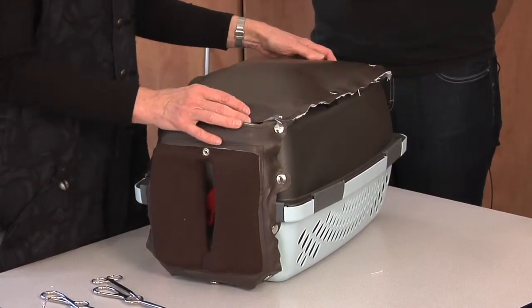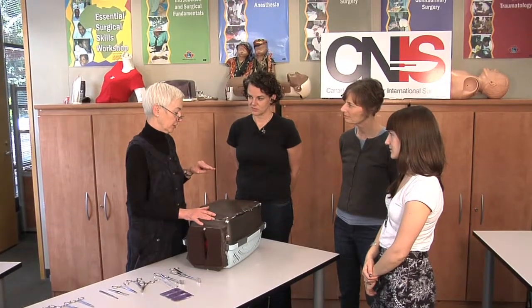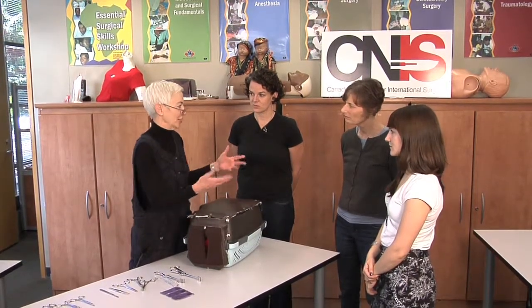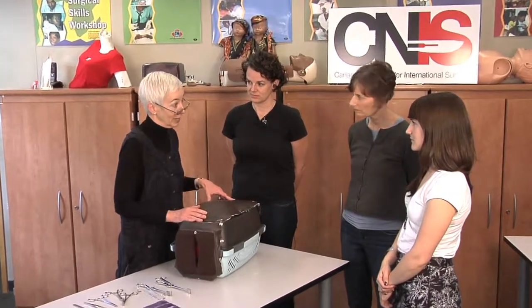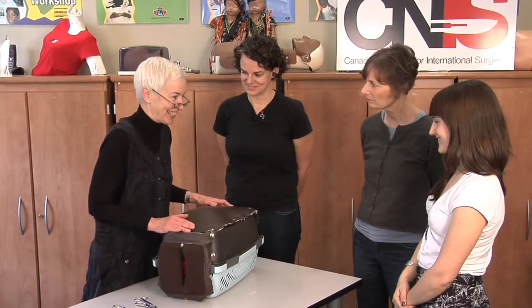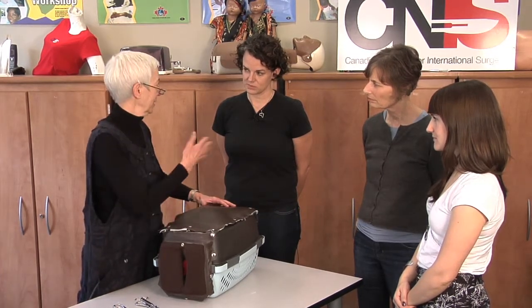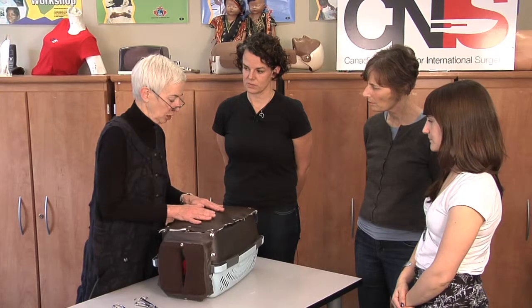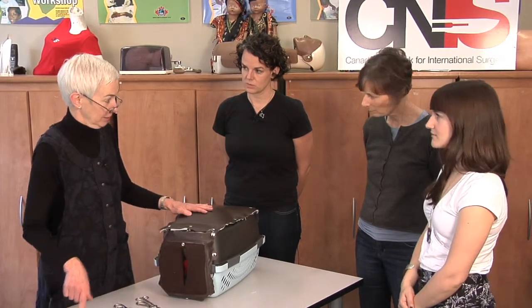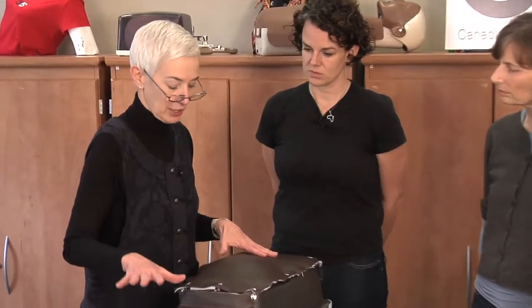We're going to do some of the exercises that the learners would do in the course. The course begins with three practical exercises. One is practicing knot tying — that is the most important thing, because it's a pretty important skill for the surgeon to be able to tie a good knot. We also practice laparotomy technique — laparotomy just means opening up. We practice making an opening in the simulated abdominal wall and then closing it up with stitches. These are the fundamental skills you need: the ability to tie a knot and the ability to open and close the abdomen, no matter what the operation is.